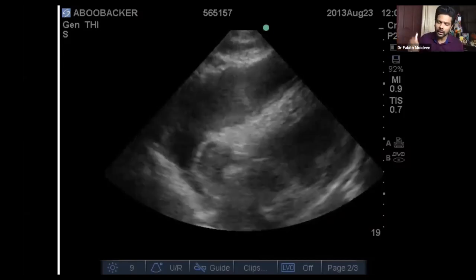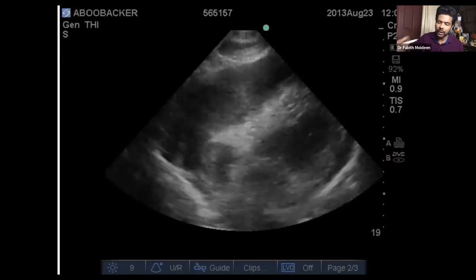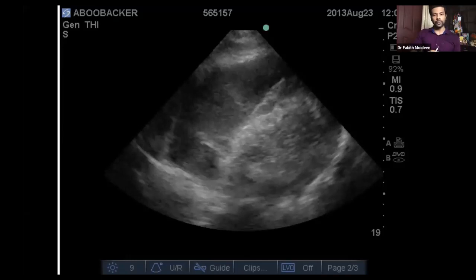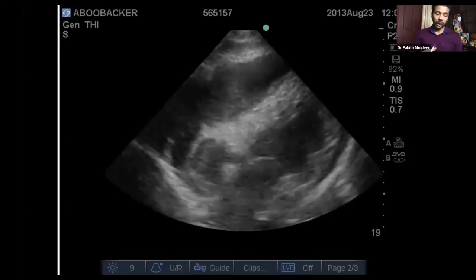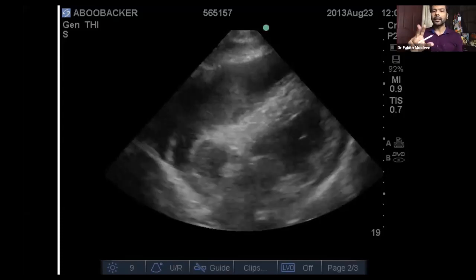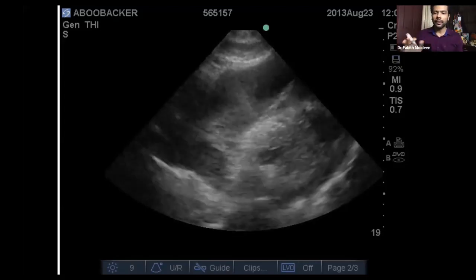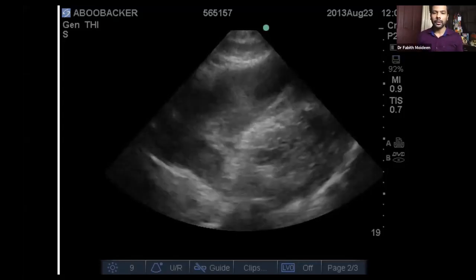If a patient is in cardiac arrest, all the other steps are the same. You start chest compressions, and during the next pulse check, one person makes sure that while they are doing the 10 seconds, you do a subcostal view. That's the best view during cardiac arrest, according to the literature. Record it for 10 seconds, because you can't look and finalize it live. If you find the heart is beating while you're not feeling the pulse, that's pseudo PEA. You need to act aggressively, look into the reversible causes, and do as much as you can.